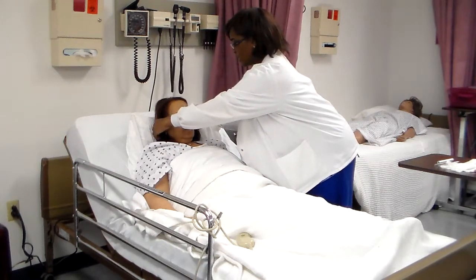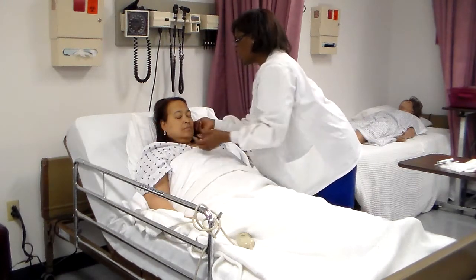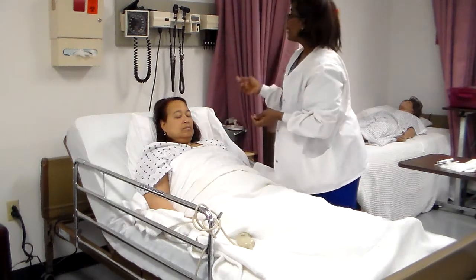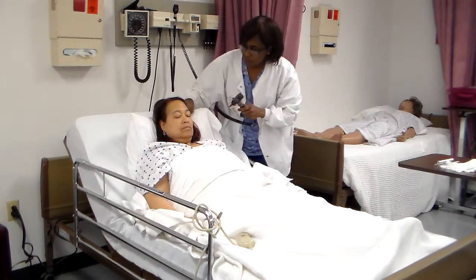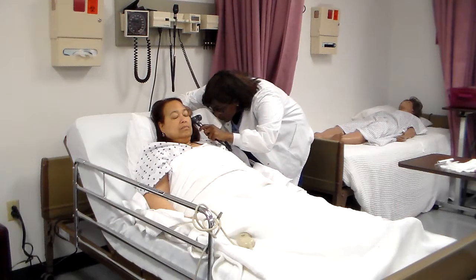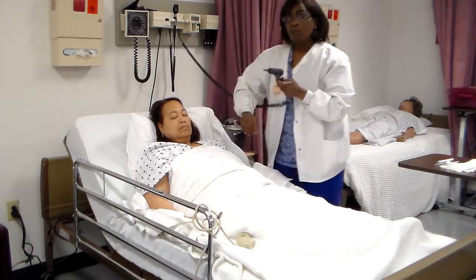Do you have any pain? Is this sensitive? Does this hurt? And the client stated no. You're going to make sure there are no lesions, no nodules, no excessive drainage. Then you're going to go ahead and look into the internal ear. So at this time, you're going to assess to see if you see any cerumen, which is earwax. And you're going to look on both sides.